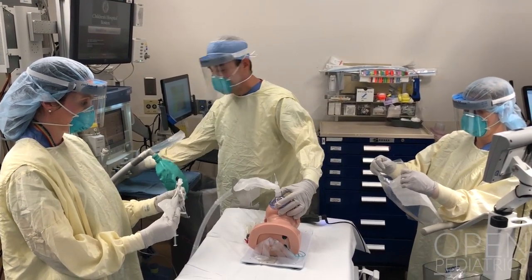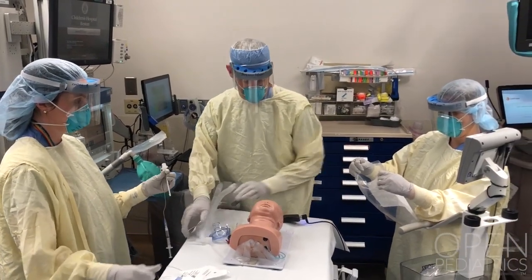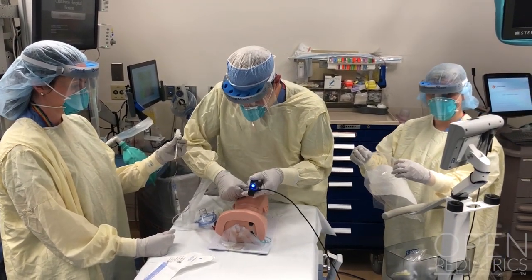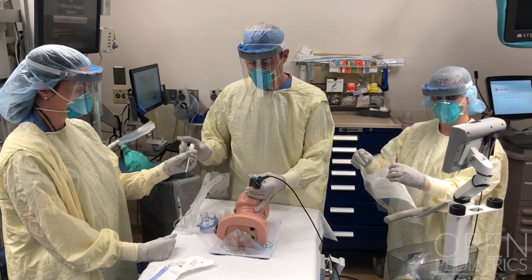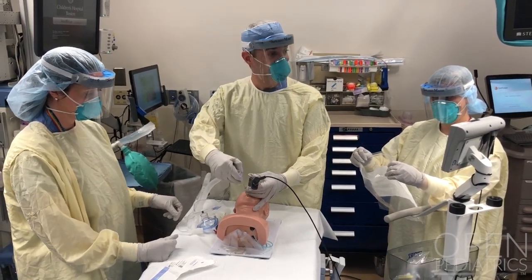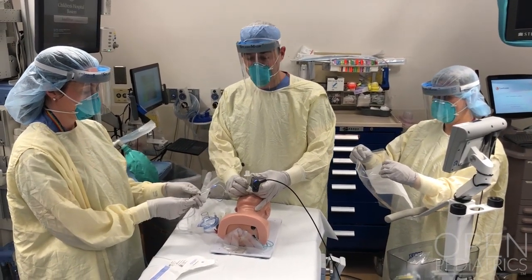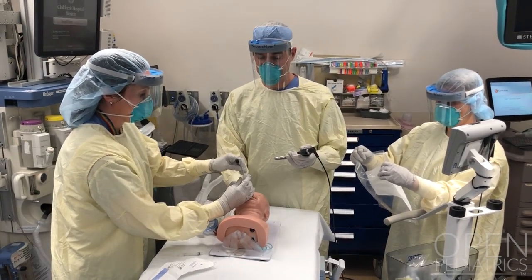It's important to disconnect the mask so that the circuit can be immediately connected to the endotracheal tube. Using video laryngoscopy, we find our view and place the endotracheal tube, and the additional airway provider is immediately ready to inflate the cuff and then remove the stylet. The stylet is then discarded and the circuit is immediately connected to the endotracheal tube by the second airway provider.